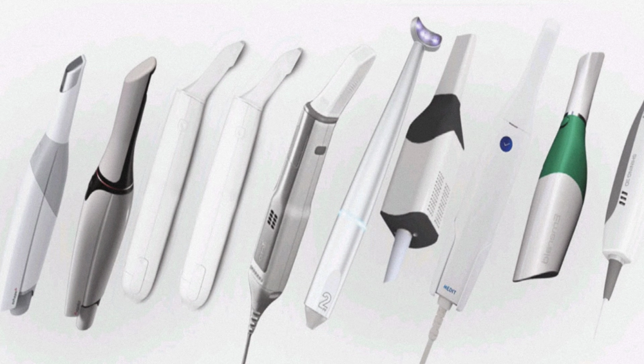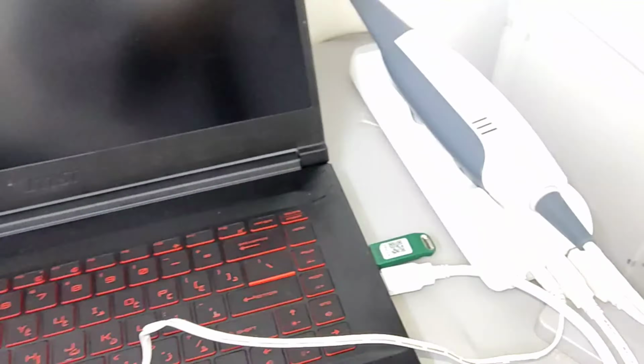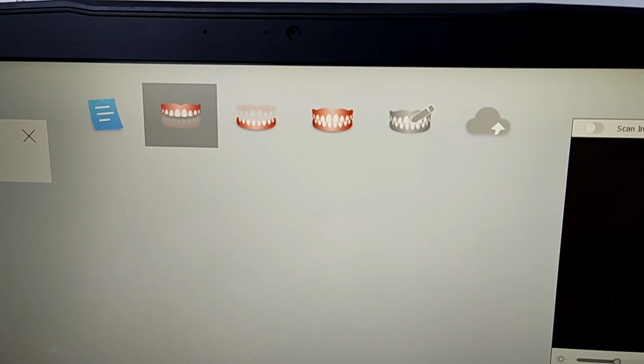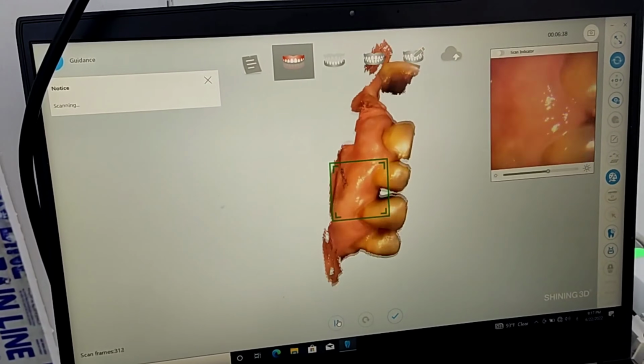Intraoral scanner for RPD. Intraoral scanner has several advantages. For example, intraoral scanner helps people with gag reflex and limited mouth opening. And it also eliminates the risk of dimensional change of dental impression and dental cast.